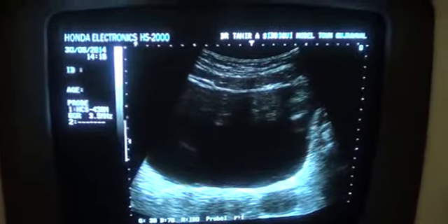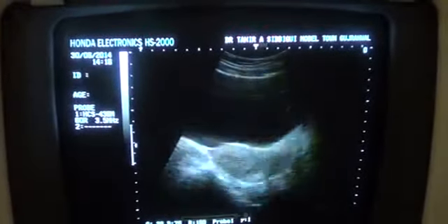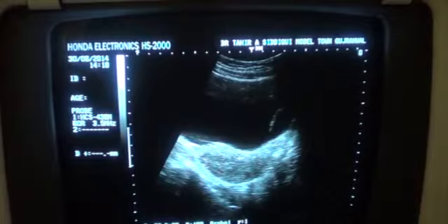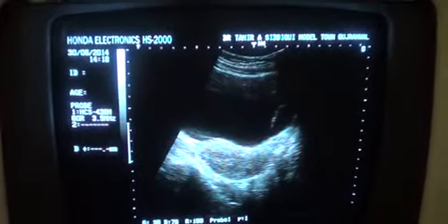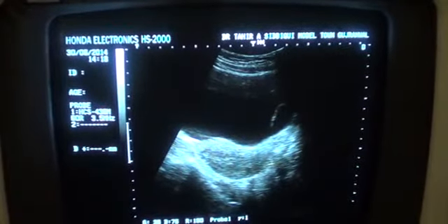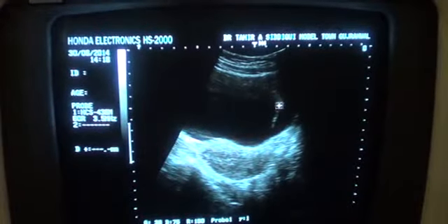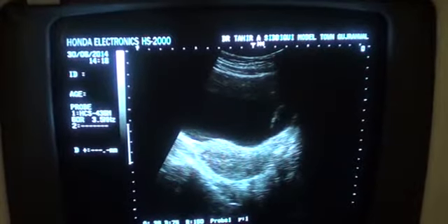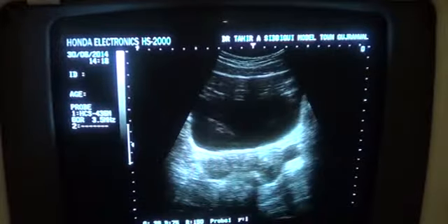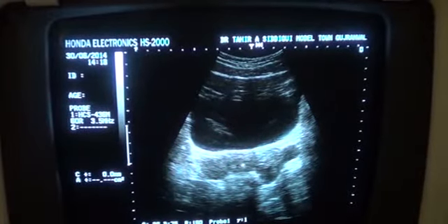Now if we see in a mute figure, you see that the uterus is normal, the urinary bladder is overfilled, and this is the ureter in longitudinal section. This is the uterus in longitudinal section, urinary bladder in longitudinal section. This is the part of the ureterocele that you are seeing. Here we see the left ovary. This is the left ovary, this area. You are seeing developing follicles in it.